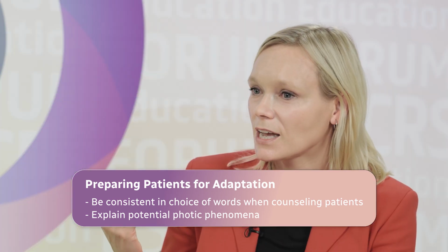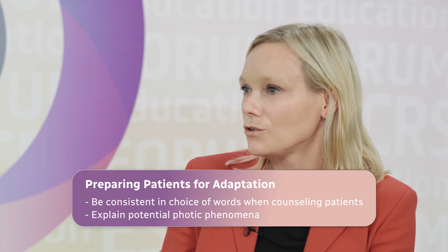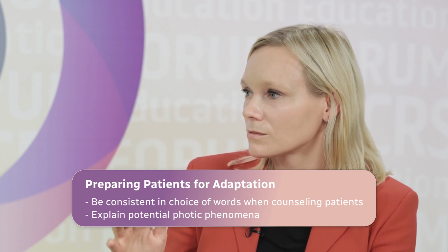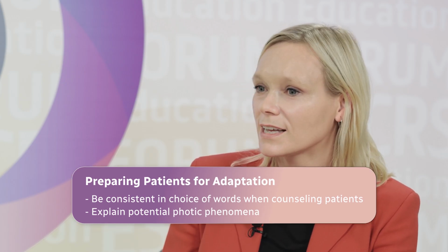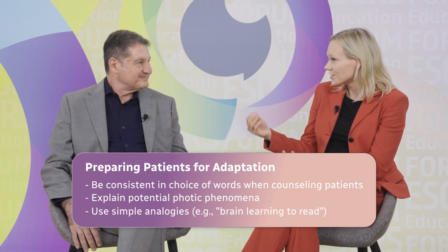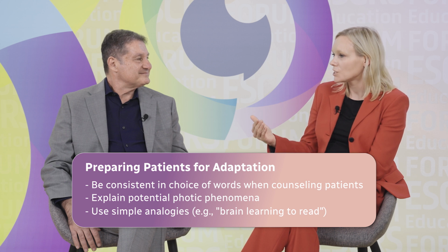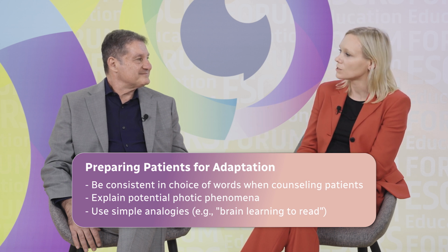I explain, even during the surgery when I implant the lens, I tell them, you may already see the circles, the design of your new trifocal lens, as when kids are taught how to read sentences, the patient needs to also teach his brain how to read with the new lens.